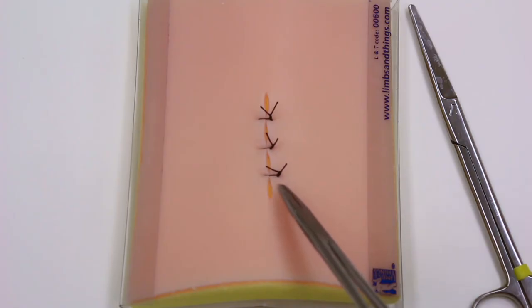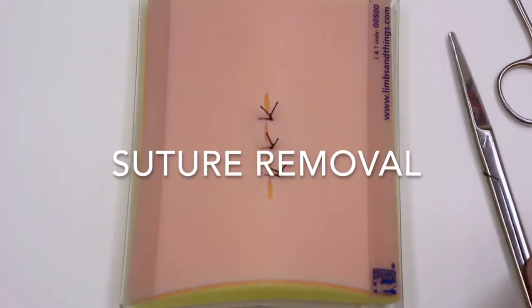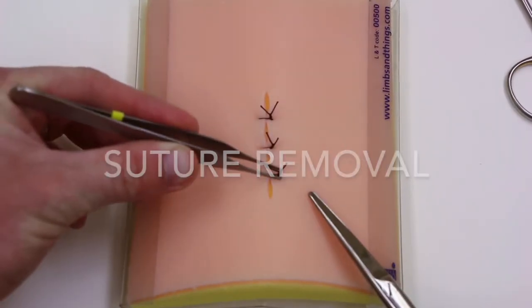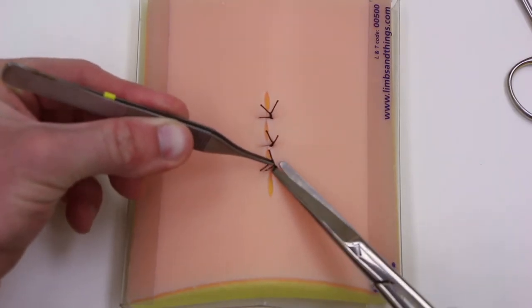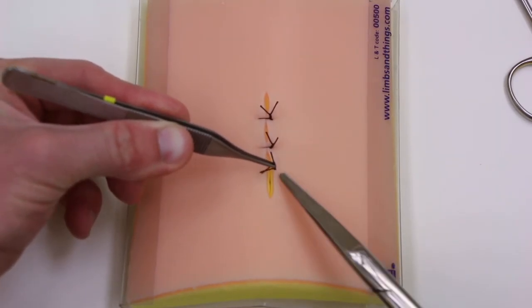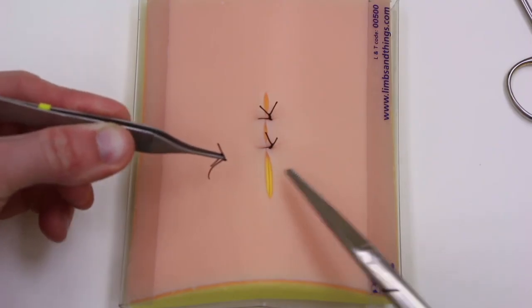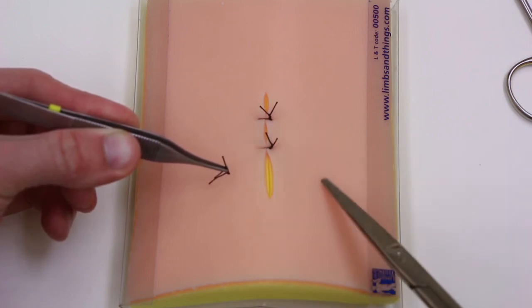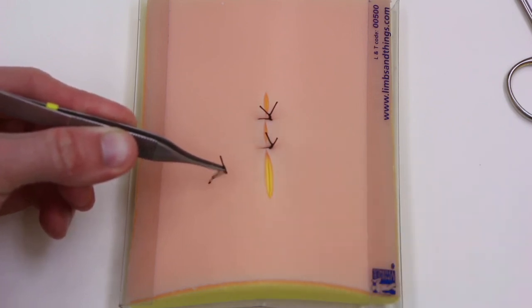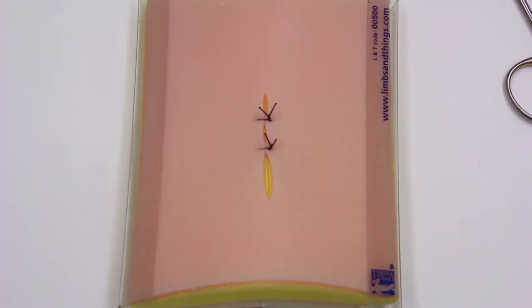If you're having to dig around in their scab to take off these sutures, a person's going to hate you. When it comes to taking these out later, you can then pick up the knot, which is not incorporated in the scab. Expose that little end. Cutting right at the skin, pulling out. You minimize the amount of suture that's been on the outside that you're dragging through the skin. So not trying to seed any infection. It's pretty easy to remove things. Okay. So that's the idea with your Simple Interrupted.